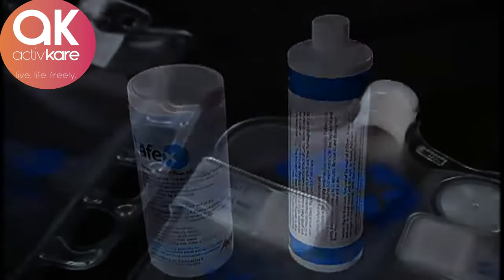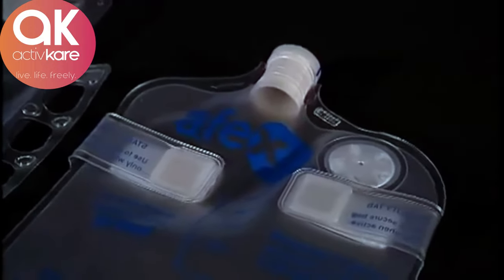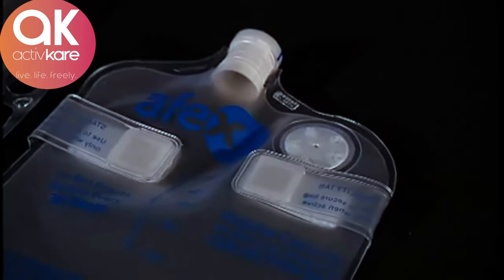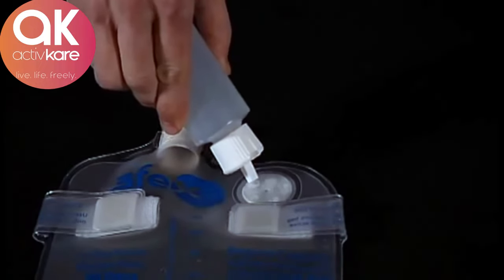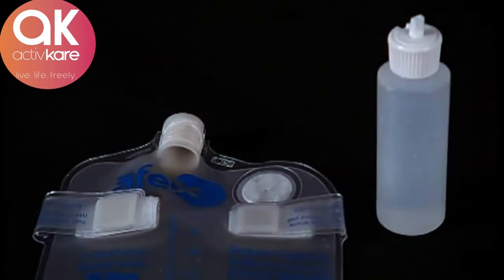For vented collection bags, which feature a white membrane, there is an additional step to remove impurities which can impact performance. After cleaning with cleanser, saturate the membrane with regular household rubbing alcohol. Then allow the membrane to dry completely before using the bag again.